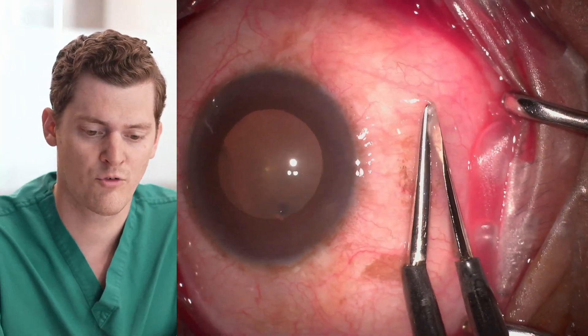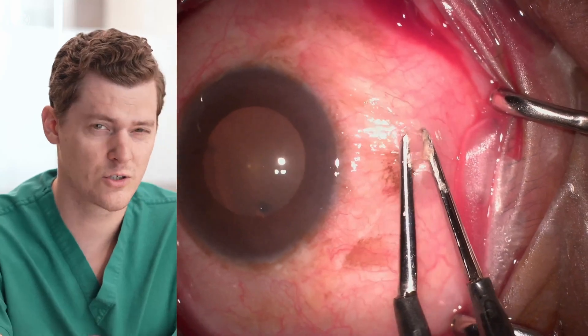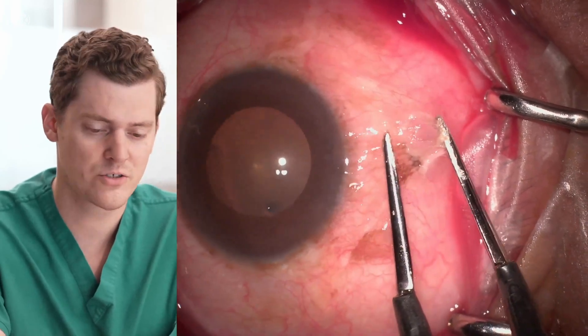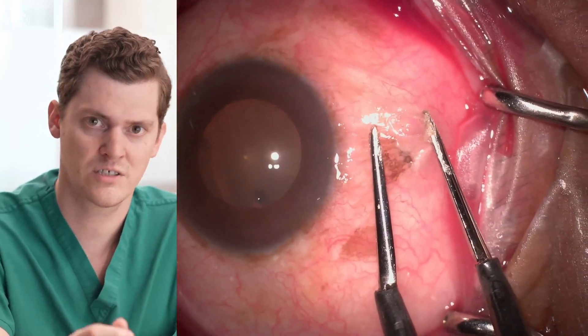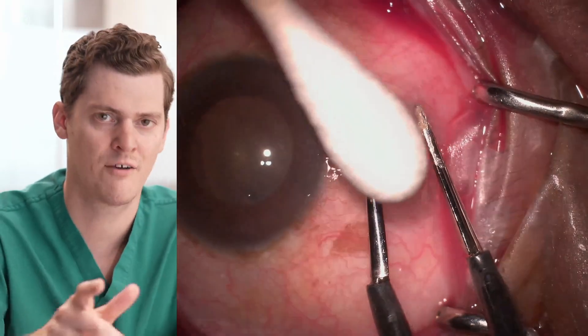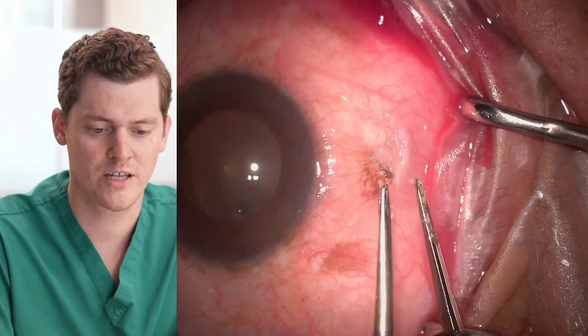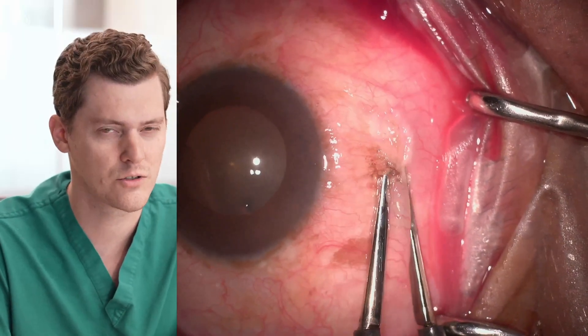You see these cautery forceps — I pinch the conjunctiva and then cauterize. This first pinch was a little bit too hot and too long, so you see the conjunctiva sticking to it a little bit. I have to get a Q-tip and sweep off the conjunctiva, then adjust some of the settings to make sure I'm not burning the conjunctiva too hotly.